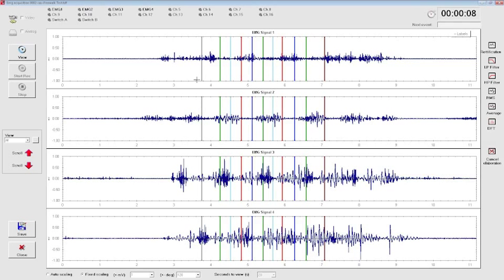Here you can see that we have several lines on each EMG signal. Here on the labels you will have the legend of all the instants detected on the EMG trial. And as you can see, we chose to use a protocol in which the signals will be EMG signal 1, 2, 3, and 4.